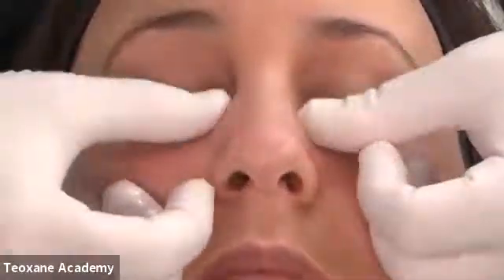Do you have any questions? It's a classical injection to do that. It's a classical injection, and so I think a lot of you are doing the same as me. Some use a needle, but never for a Caucasian lady use a superficial injection. Remember that Redensity 2 is a product with the IFU, it means the recommendation. It's a product that you need to use deep and not superficial. Even if I know that some of my colleagues in Asia use superficial injection.